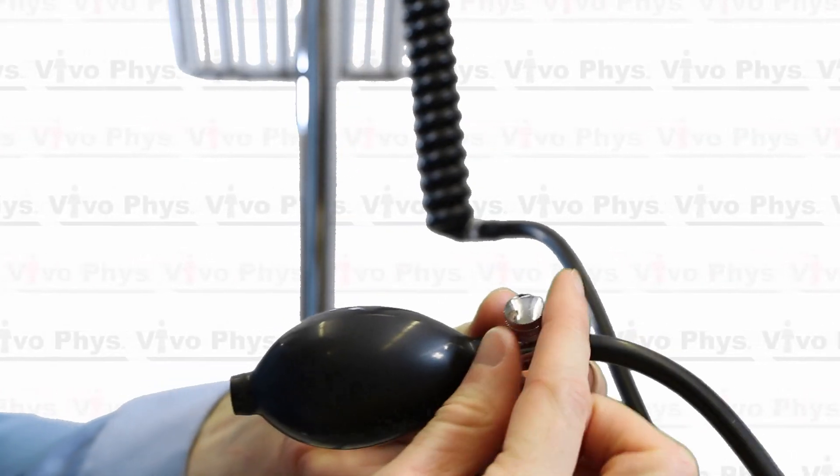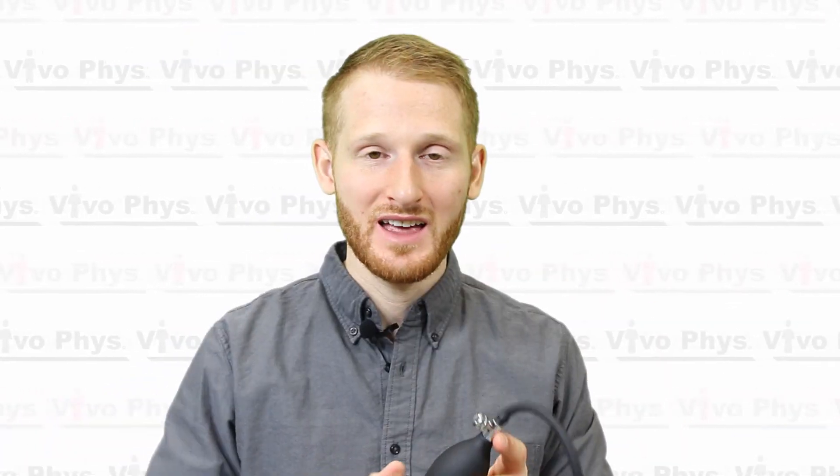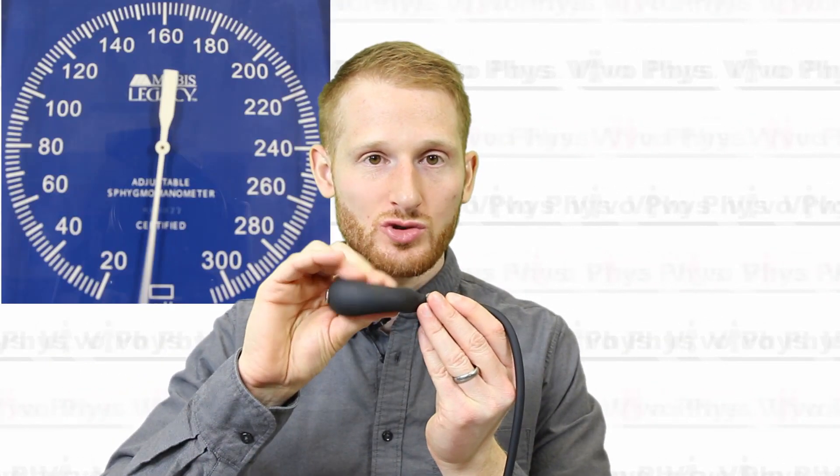When you're ready to take the measurement, twist the knob on the bulb all the way to the right — just finger tight, don't overtighten or it will be hard to open and you'll release pressure too quickly. Then squeeze the bulb to inflate the cuff to at least 40 millimeters of mercury above the expected systolic blood pressure. Usually inflating to around 200 millimeters of mercury works, unless the person has severe hypertension or you're doing maximal exercise testing.